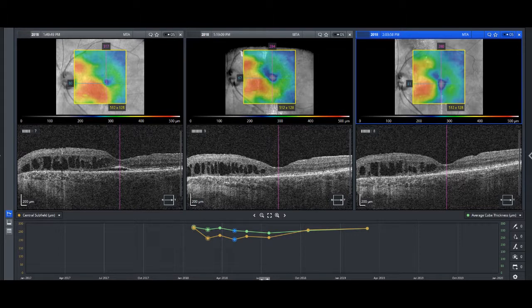In today's case, what we're going to be looking at is that of a 91-year-old man who presented to me, and I've been following now for some time. The diagnosis is that of a peripapillary choroidal neovascularization, and I think it's just interesting to note how this can appear on OCT. I am not telling you that there's no differential diagnosis to this.